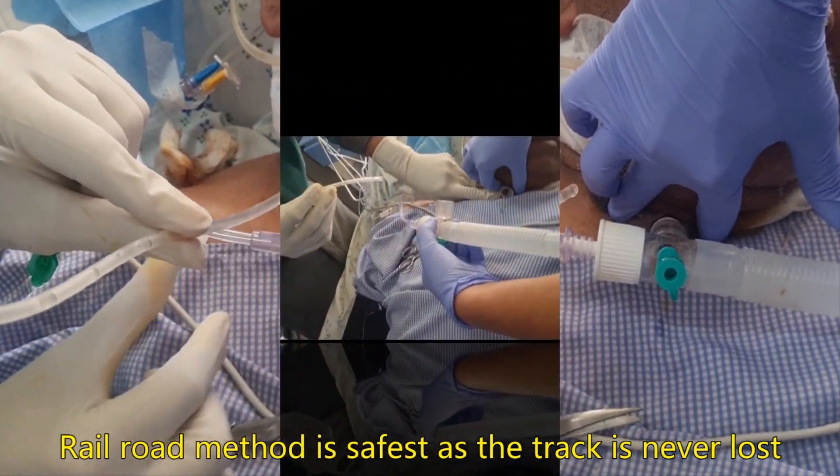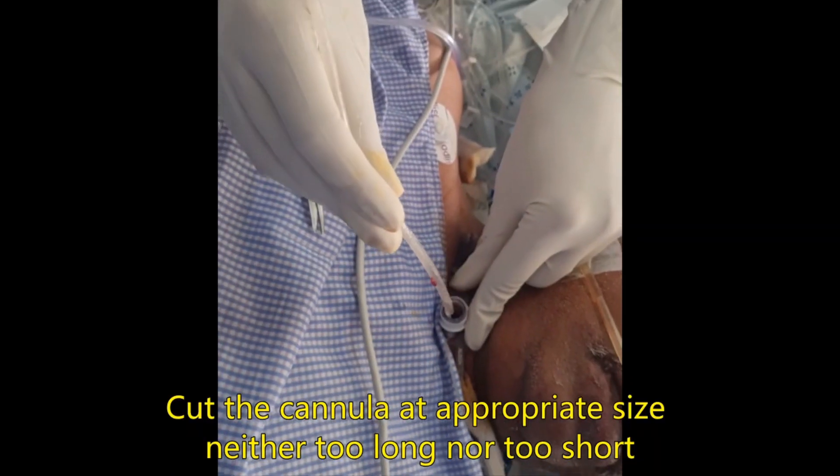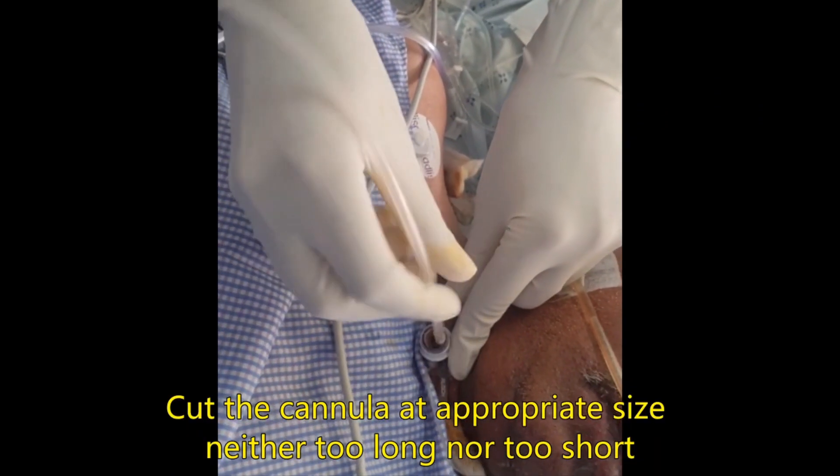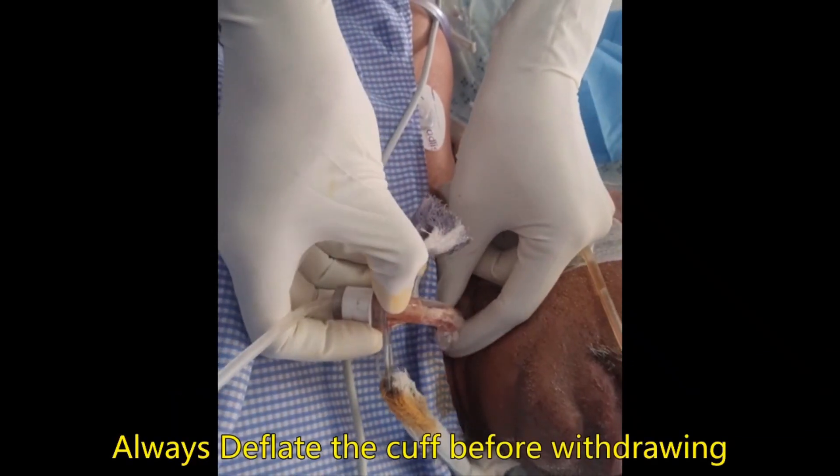We will now demonstrate the procedure. We detach the oxygen attachment, insert the suction canula inside, and on the suction canula we withdraw the old tube.